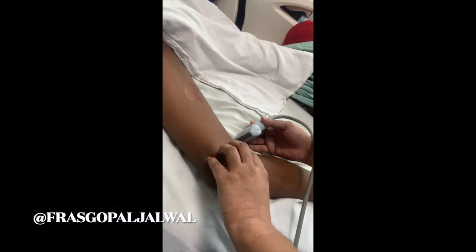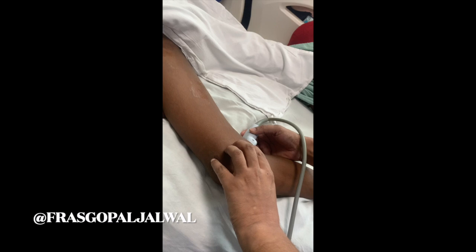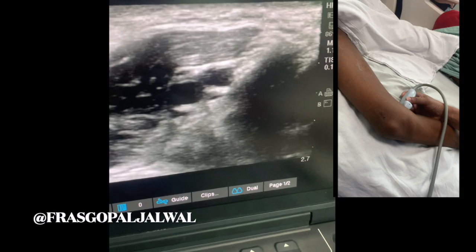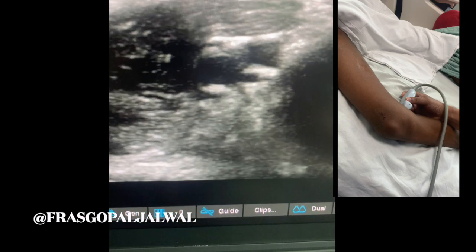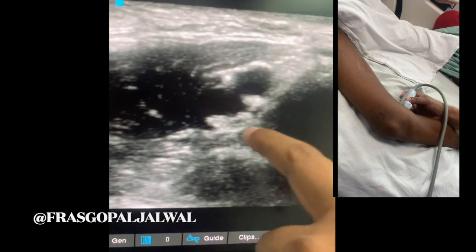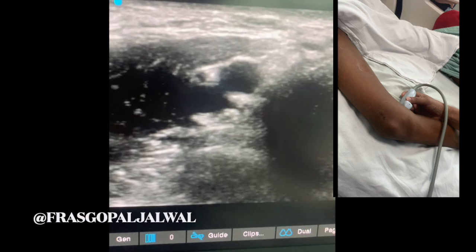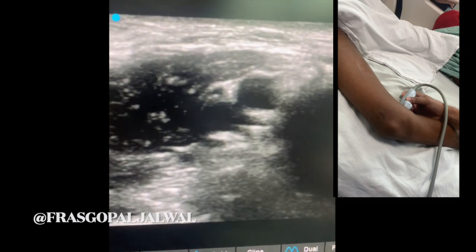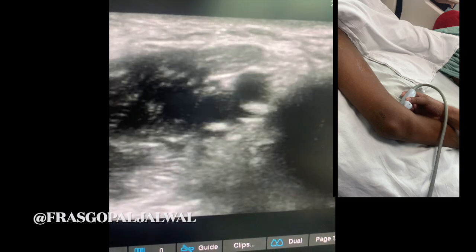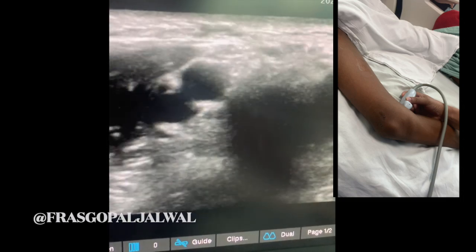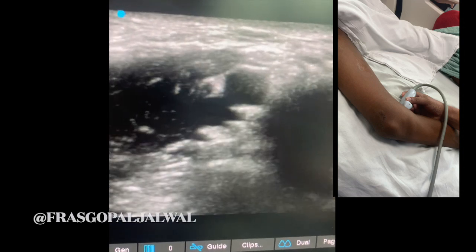Now I am going to scan the popliteal fossa. When I place my probe over the popliteal crease, you will see one pulsatile structure — that is the popliteal artery — and another non-pulsatile structure, which is the popliteal vein. To assess for thrombus, I press the probe, and here you can see that the popliteal vein is completely compressible. That indicates there is no thrombus inside the popliteal vein.